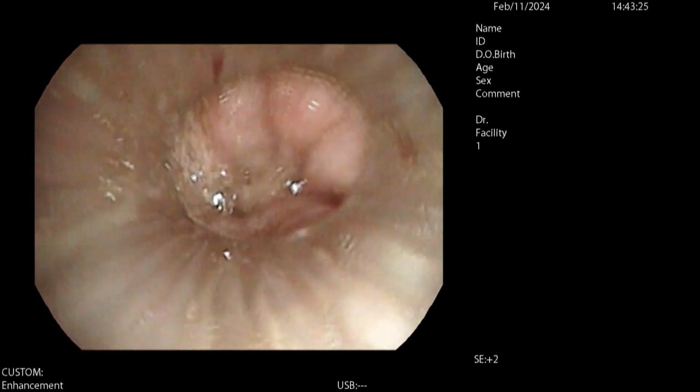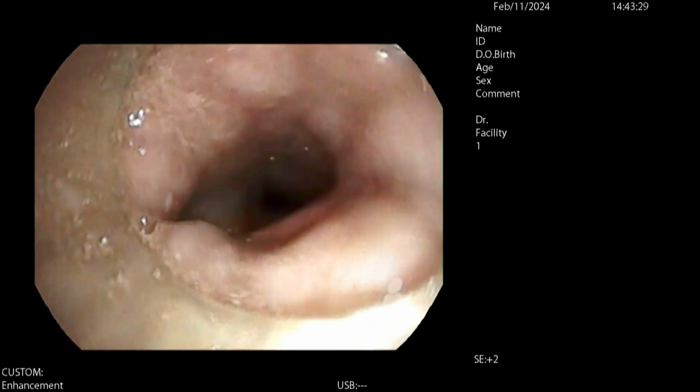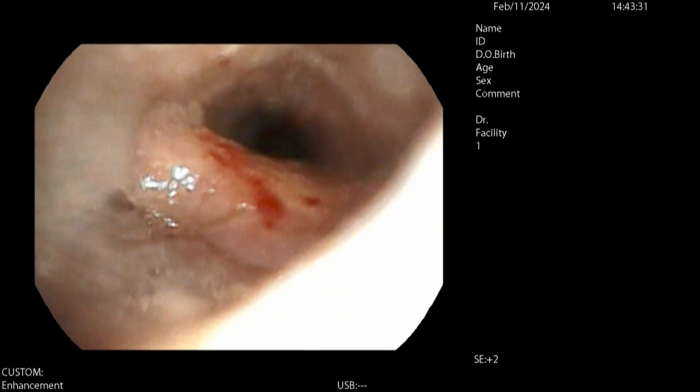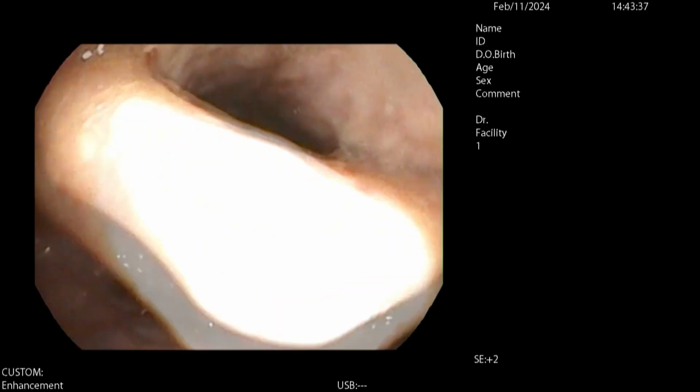Sanjay, we are with you. So we have passed the airway. Can you change the 2 to the other side? In spite of the airway, you can see that there is a lot of collapse there. Can you see the epiglottic collapse, sir?